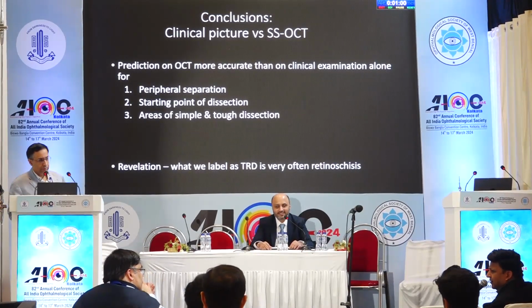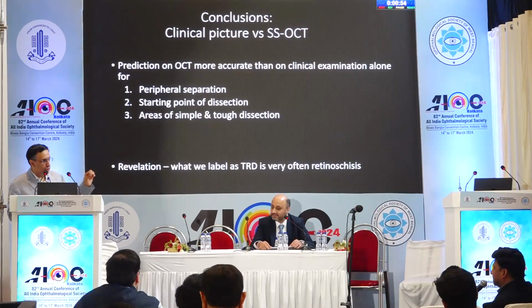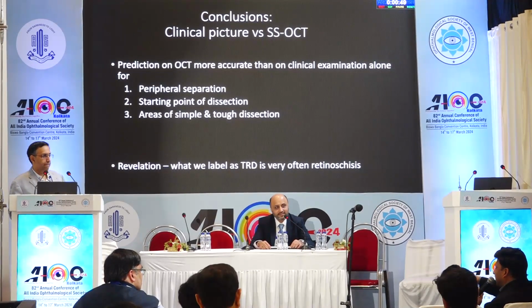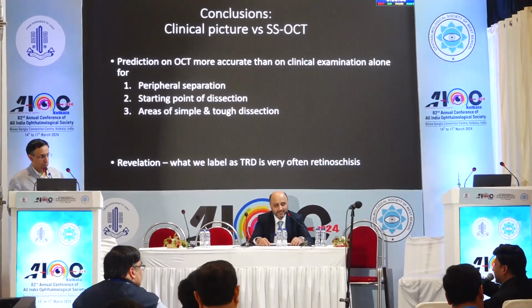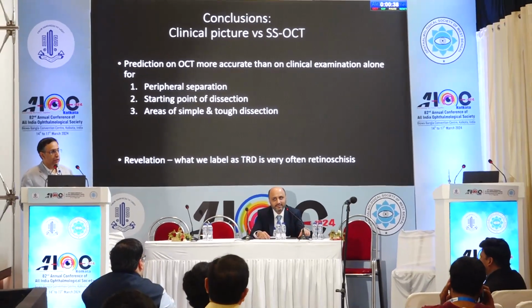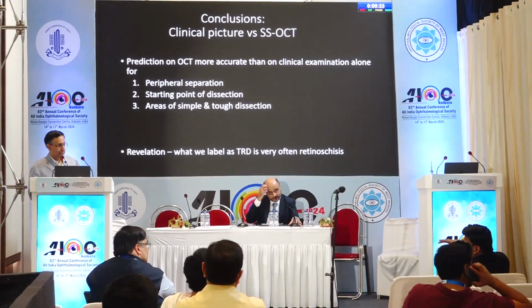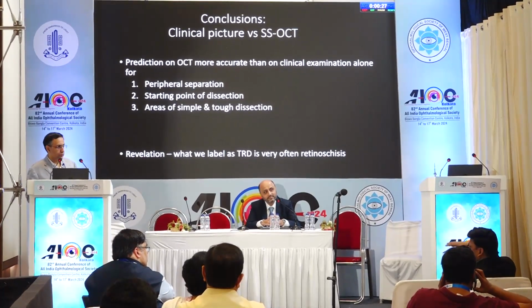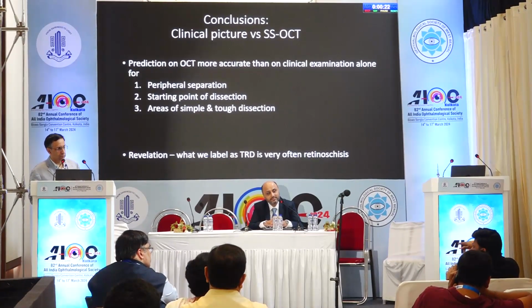Yes. It can happen. I've seen it even in a younger age group, it's more common. The sheen is also there. Once you start exploring it, you'll see that it is getting taut, and it is very adherent. It does not come off so easily. It may even cause breaks. But do you think sometimes it is better to leave it alone? It depends. We actually did a study, but it was a very small sample size, so I can't conclude on the basis of that. But we have seen more post-operative vitreous cavity hemorrhages and post-operative ERM formation if we leave that. Right.